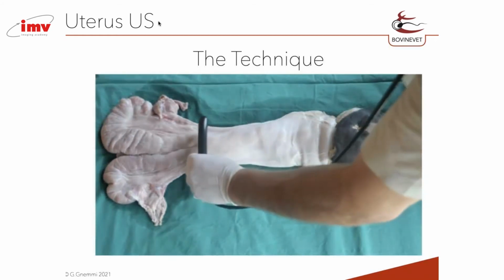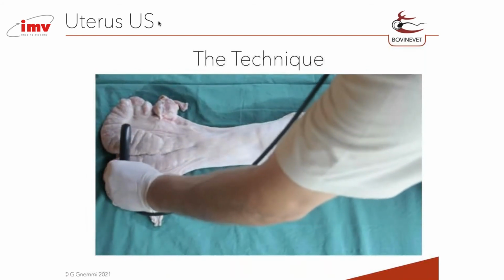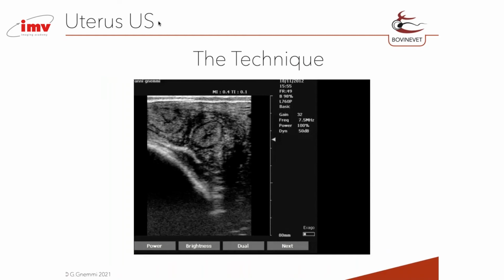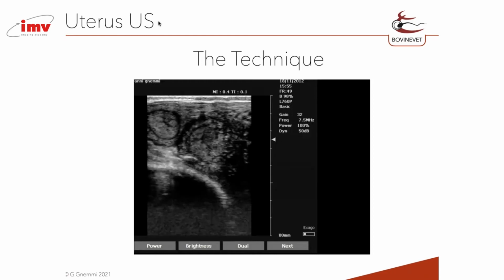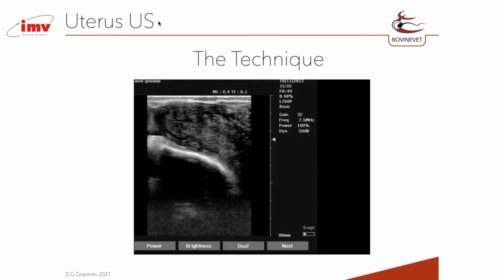You see the movement. When I speak of ultrasound evaluation, the only secret that I suggest to my students or to the colleagues that I like to share with is that there are no secrets. You have only to move the probe very, very slowly, and you have to maintain perfect control of the probe with your hand.